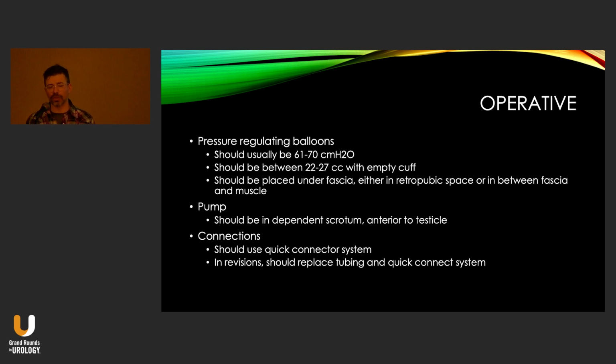The idea, of course, is to put less pressure in the urethra, especially in a radiated patient, to prevent atrophy, but in my experience when I've had this in the past, what it really does is just not give you enough continence. The pressure-regulating balloon works within a certain range. It's not one of these things where the more fluid you put in, the more pressure it gives. And I have seen people make that argument, but it's just not true. This works within a range.